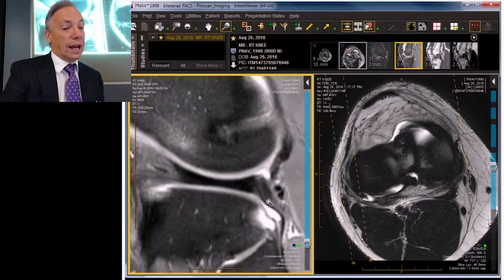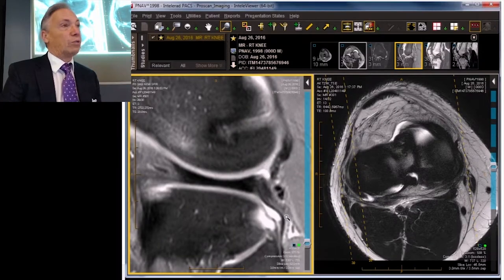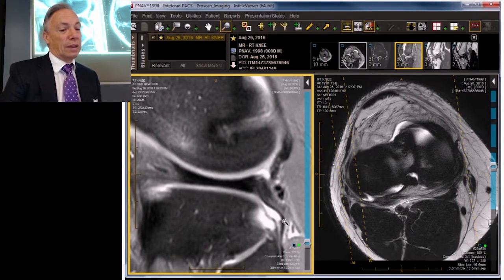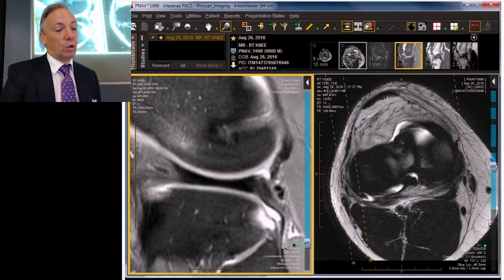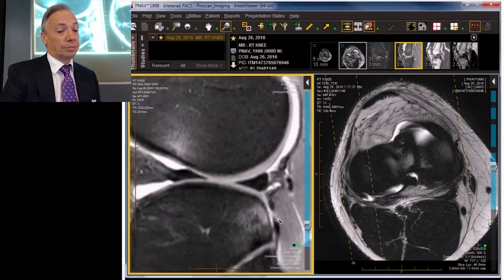Let's look at the popliteus tendon, because when that happens there is frequently an injury to the popliteal fibular ligament — either a rupture with a squiggly little tail rolled up in a ball, or a wavy tail from a stretch. We have the wavy tail, known as the mermaid sign. There's the body of the mermaid and the wavy tail, which should be a straight black line. Instead, we have a gray, somewhat waddling, wavy signal from the popliteus tendon and the popliteal fibular ligament.